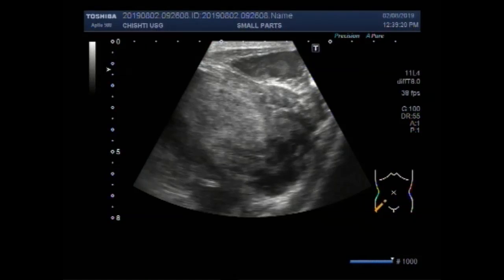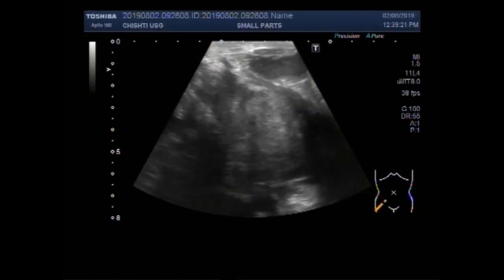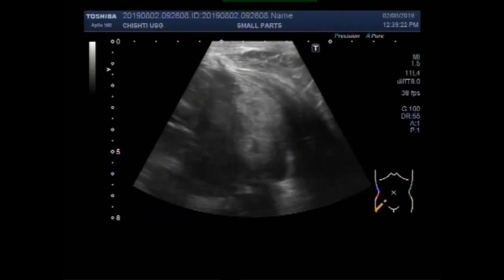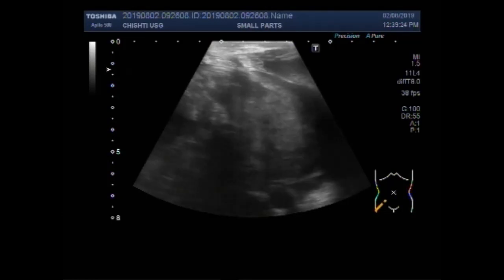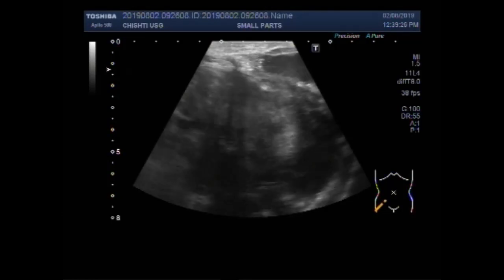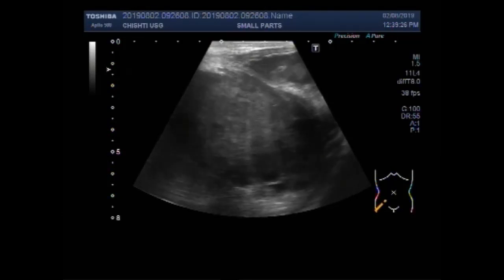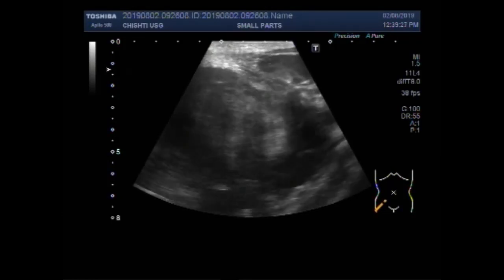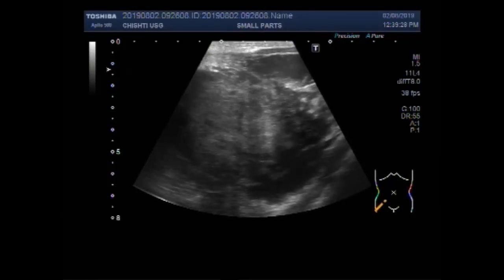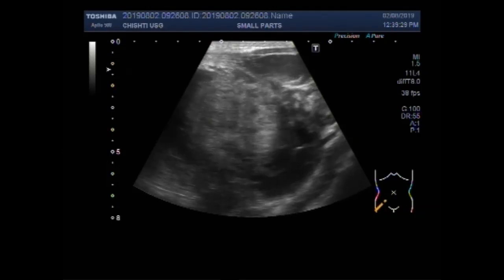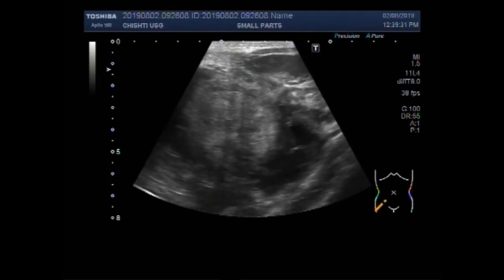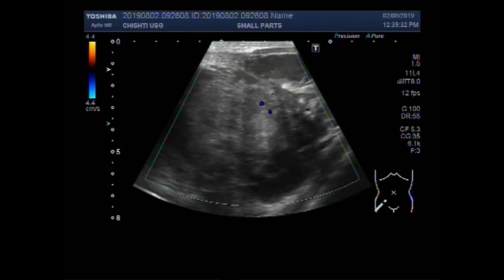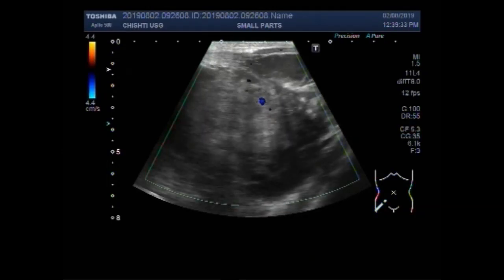Dear viewers, I hope you are all fine. This ultrasound video shows a large mass in the right iliac region — a gut-related mass.